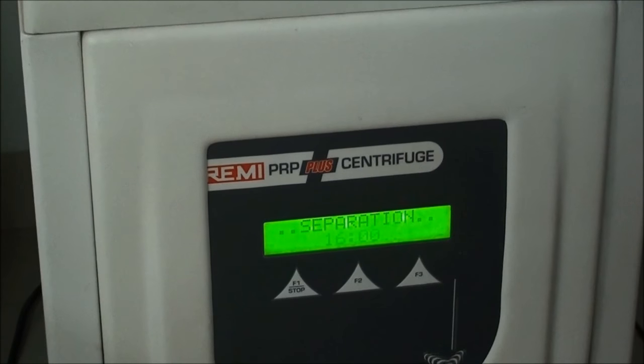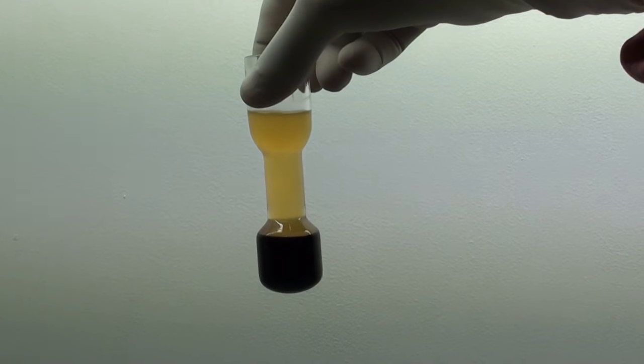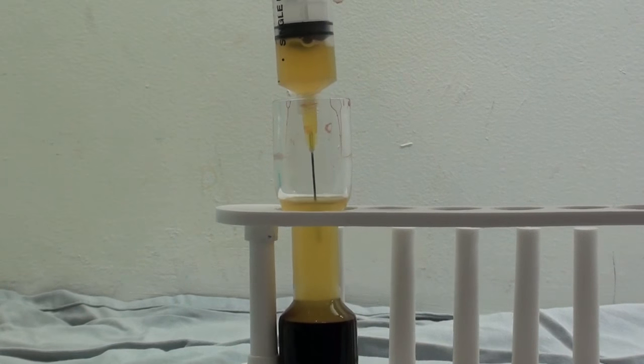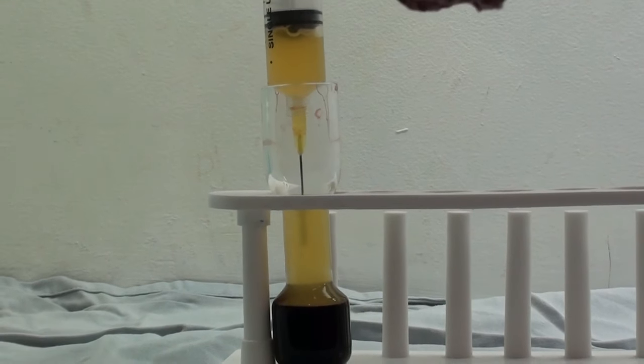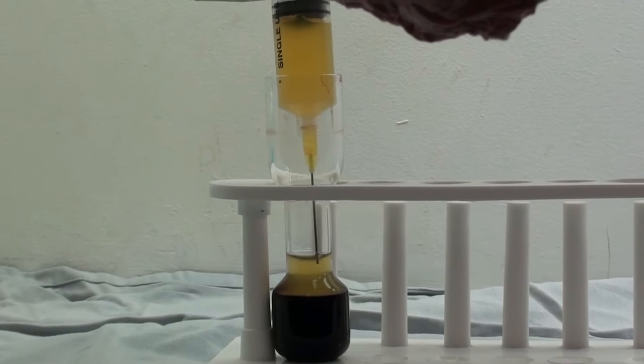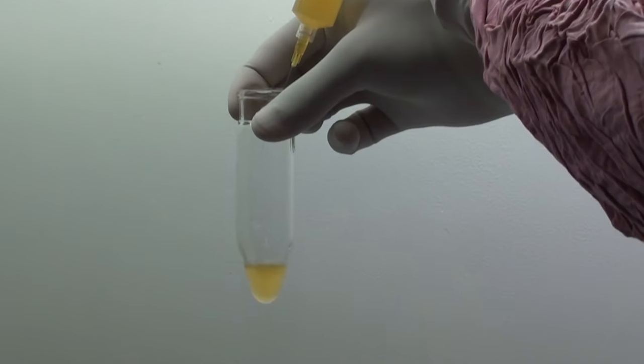Now separate it for 16 minutes — RBC and plasma are separated. Take out the plasma and transfer it into another container.